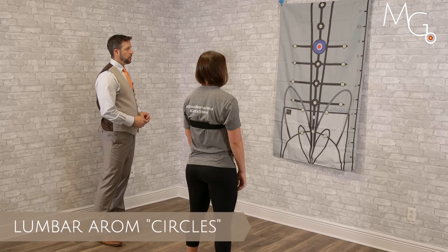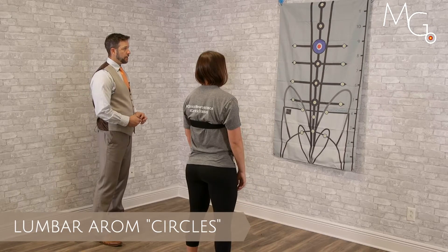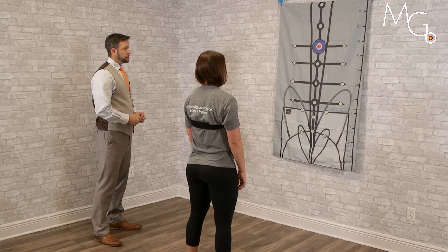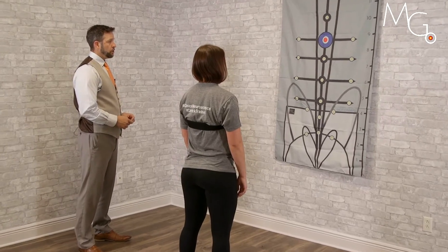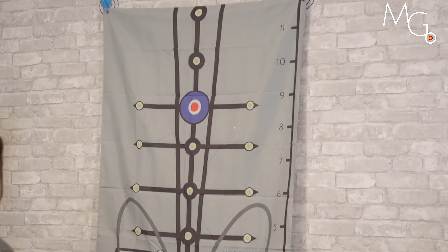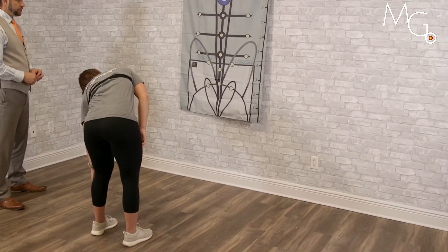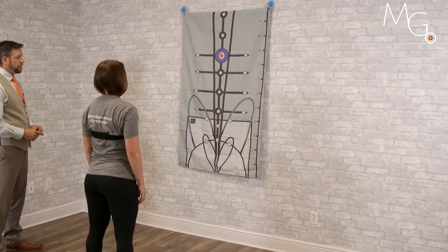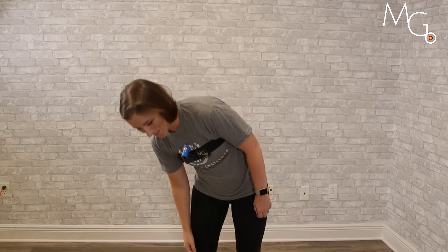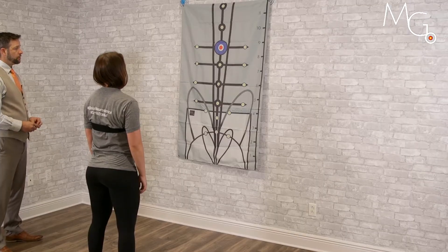Potential options for assessment of thoracic and lumbar combined motions using visual feedback can be done by placing the laser at the torso of the patient, turning on the laser and having them center that up on our target, and then having them try to get outside of our flag — drop down and around — and see if they can create symmetrical motion on each side. Variations can be clockwise or counterclockwise.